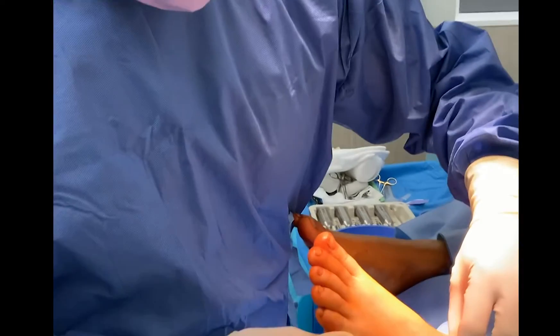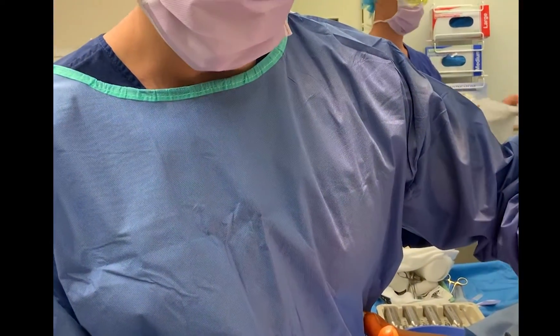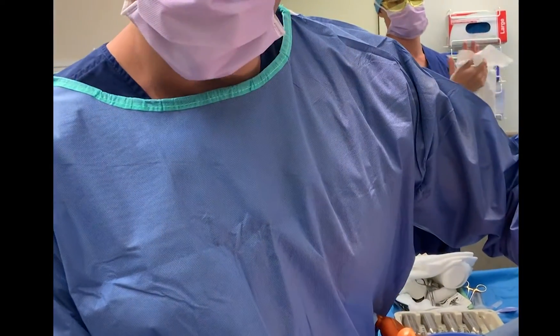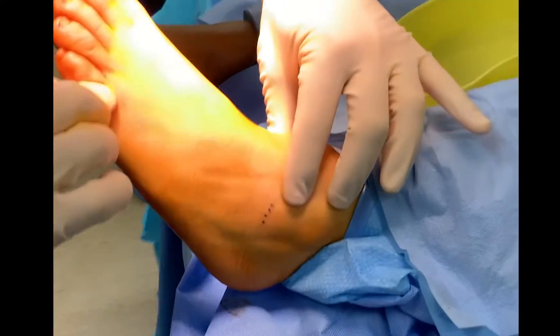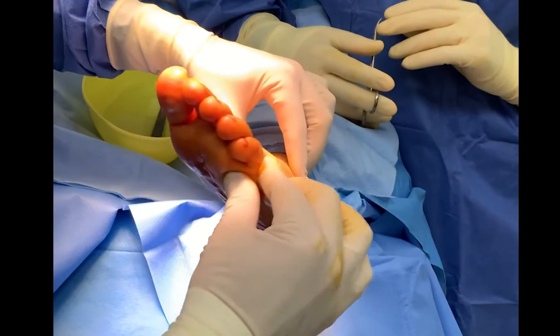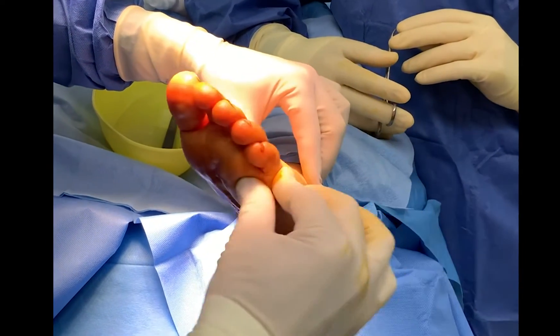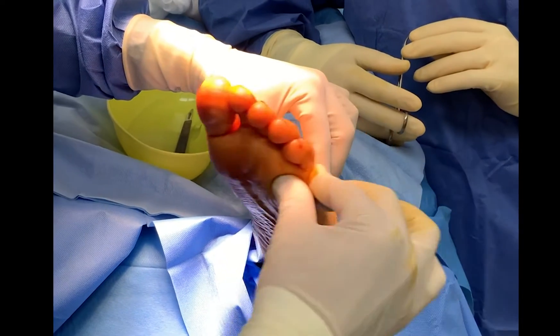So we've got an 18-19 year old girl who has symptomatic flexible flat feet. She's used orthotics previously, quite a number of them, but is still symptomatic — still getting ankle and arch pain. If we have a look at her range of motion, that is her movement at the moment, and we are going to try to limit quite a bit of that with the subtalar joint arthroresis.